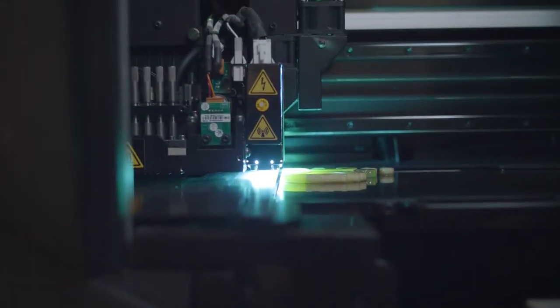So we use an acrylic monomer for the print material for the guides, and these layers are printed in 30 microns, so it's very fine. Then I send it off down to the printer, and I can even press and print overnight so that when I come in the morning, I'm just removing the support structure material and then I'm continuing with the full fabrication of the guide.